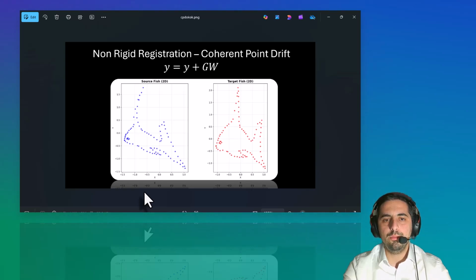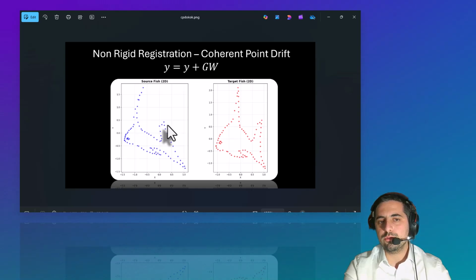It's a deformation field. So the question is how to compute this displacement field. This displacement field is composed of a Gaussian kernel and a weight matrix, meaning we can apply to each single point, for example this one, a certain coordinate, which is based on the Gaussian kernel, influenced by the points around, and also on the weight, which differs depending on the position of the point.